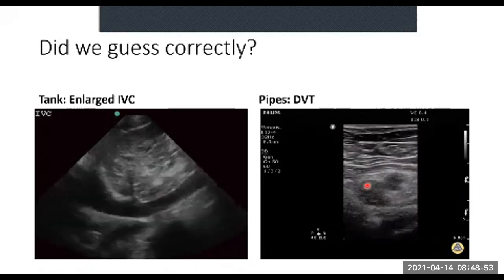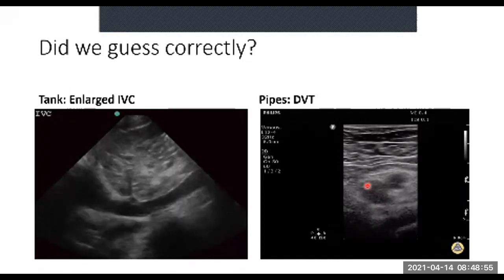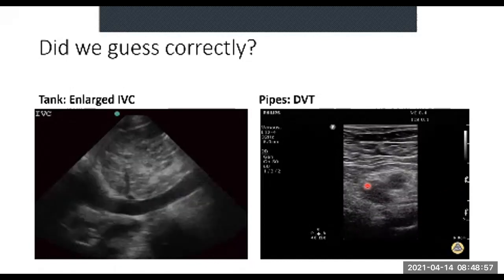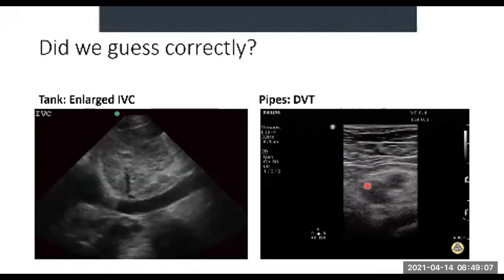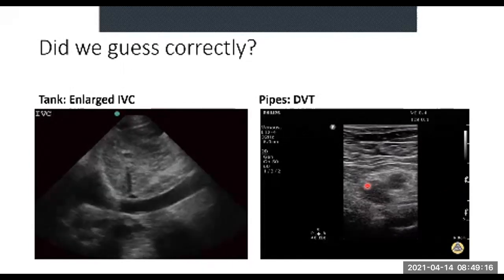So in other words, you have this patient that comes in, you suspect shock. It's not to say that you must always diagnose it clinically. You have the opportunity to use your ultrasound. Especially you want to make sure that you can use your ultrasound so that you don't fluid overload your patient and you don't use your fluids for no reason. So for example, if you've got a patient in CCF, cardiogenic shock, it's no use giving them a liter or two, you're not going to accomplish anything.